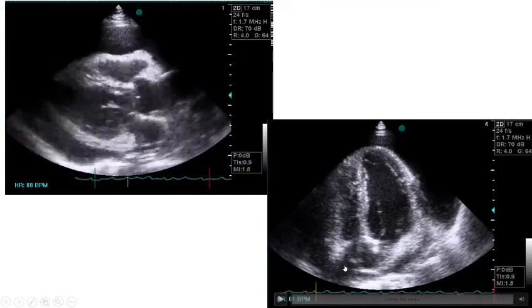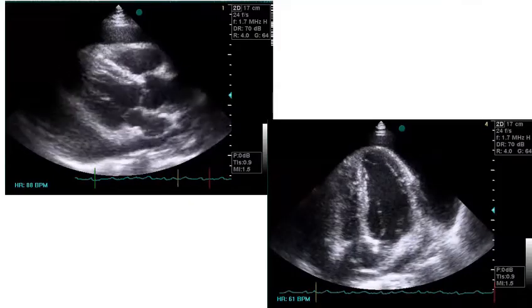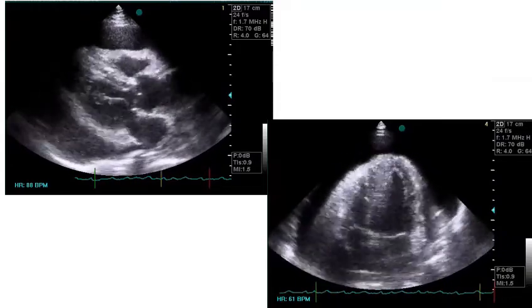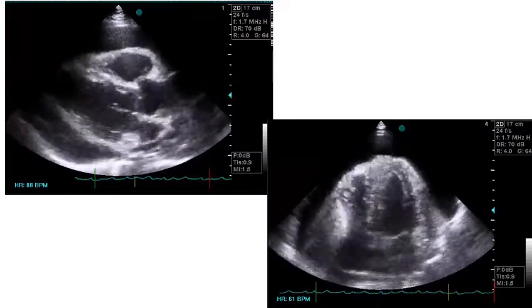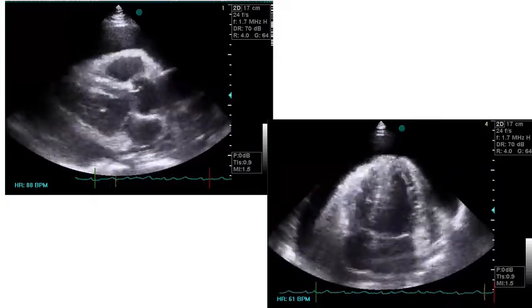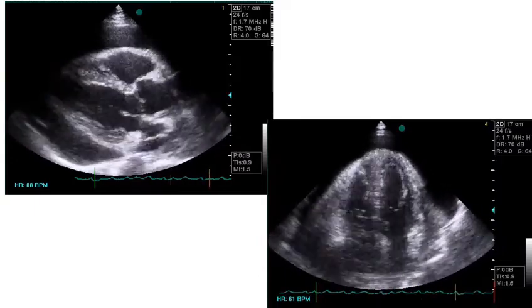Okay. In which phase of diastole do they collapse? Sir, early diastolic collapse of RV and late diastolic collapse of RA. Yeah. Why is it like that? You look for early diastolic collapse of RV and late diastolic collapse of RA. Why? It is on the filling, sir. There is only systolic filling in cardiac tamponade.